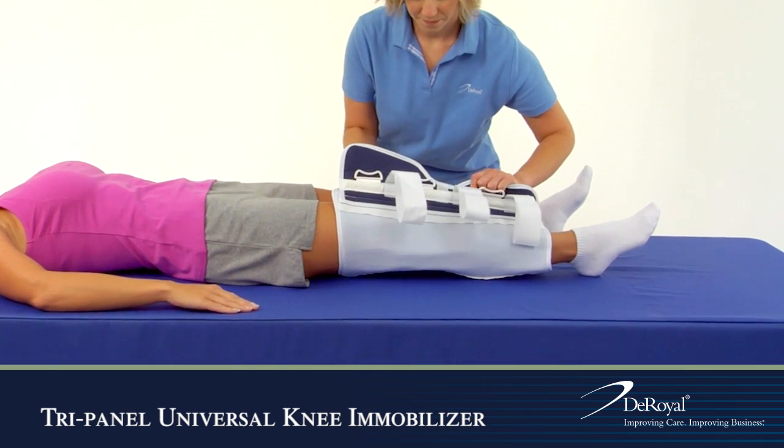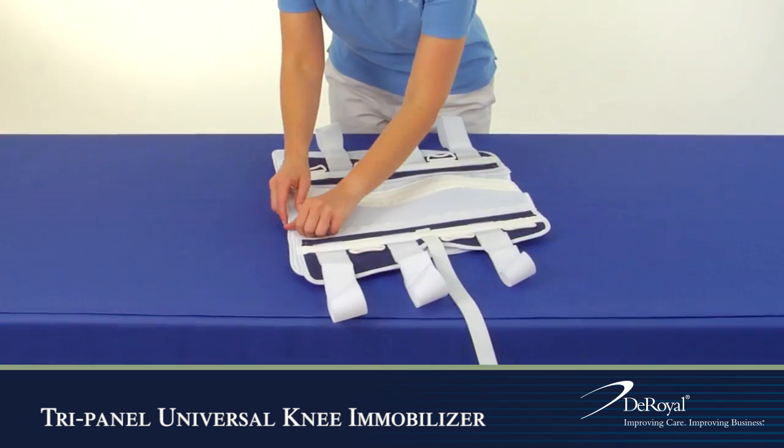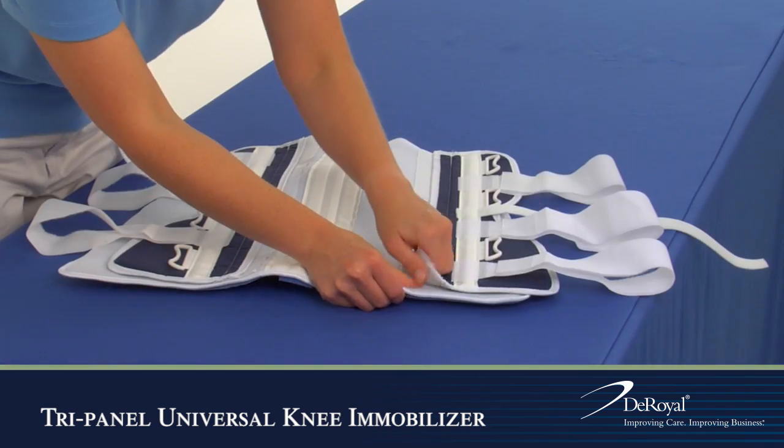Before you begin, check for sizing. You can adjust the panels as necessary for a snug fit.